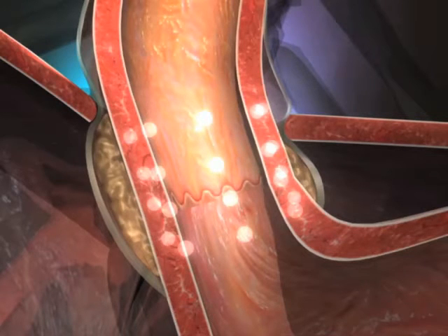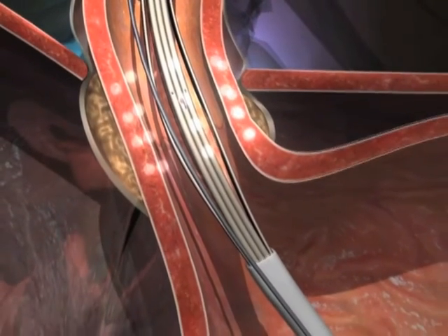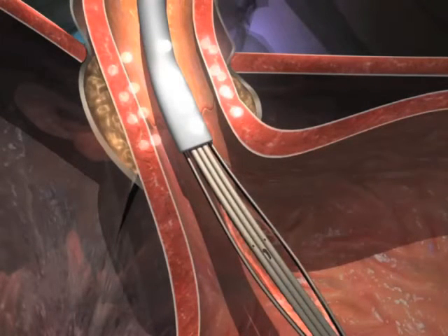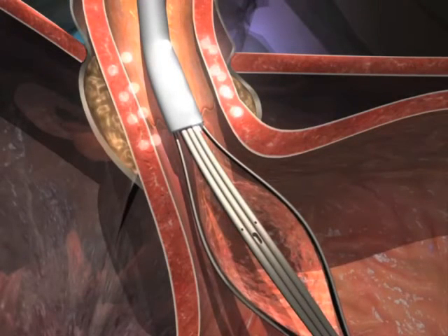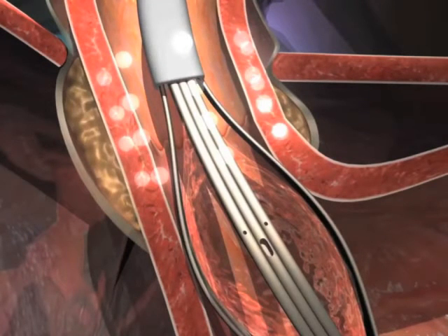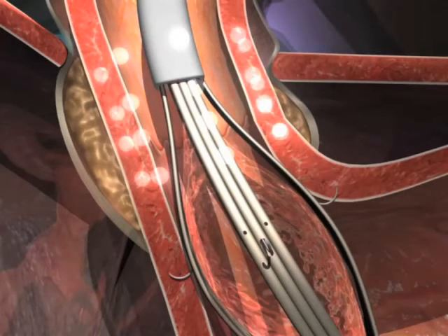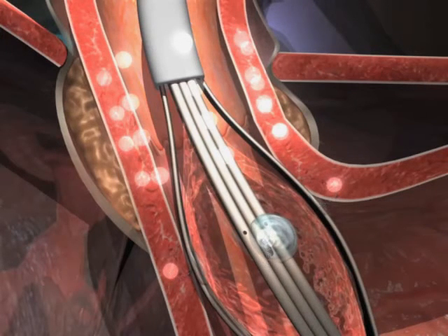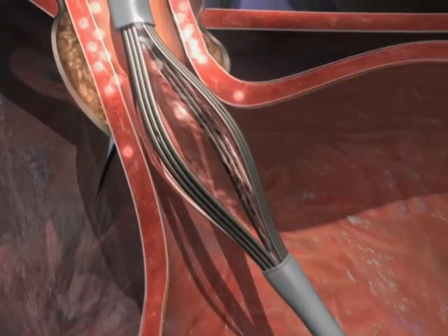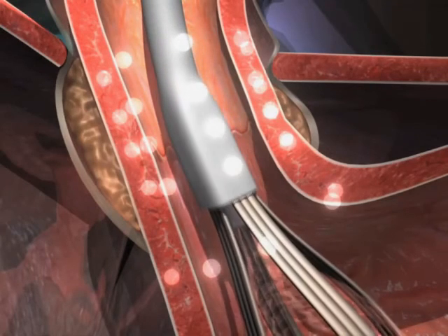Proceed to the retrograde treatments at levels 5 and 6. First, remove the pressure relief valve from the syringe — it is not necessary for the final two treatment levels. Note that the guide wire will also be removed after advancing into the stomach for level 5. For treatment level 5, advance the catheter into the fundus of the stomach and remove the guide wire. Inflate the balloon to 25 milliliters and remove the syringe. Pull the catheter back slowly until resistance is felt. Extend the needles. Observe temperature and impedance, then depress the foot pedal to deliver the first 1-minute treatment cycle. At the completion of this level in the gastric cardia, retract the needles, advance into the fundus, rotate 30 degrees to the right, pull back to the identical treatment level, extend the needles and repeat. Then repeat at 30 degrees to the left of the initial treatment.